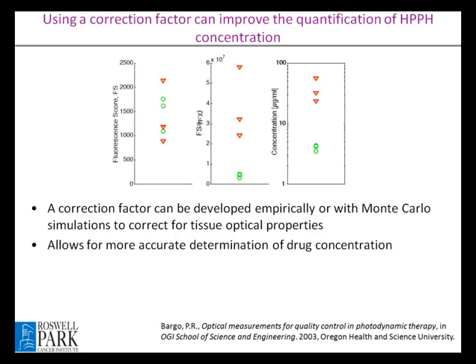For example, this is a nice example of why we need this correction. This is from Bargo, from the Steve Jacques group. This is a raw fluorescence. Maybe this was again oral cavity. I'm not sure exactly from which lesion, and after the correction is done, you see a much better contrast. The lesion shows heterogeneity, but normal tissue is really homogeneous. And then you can get the absolute quantification, the concentration of the drug. So this is the ultimate aim.